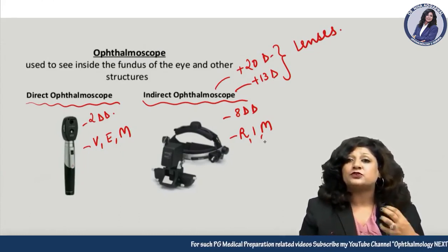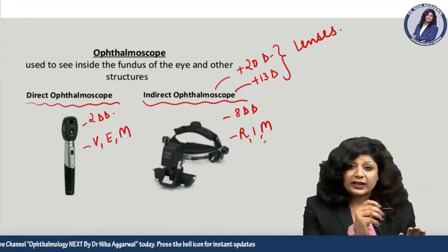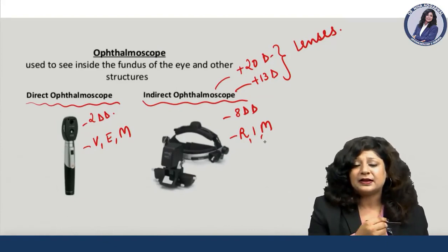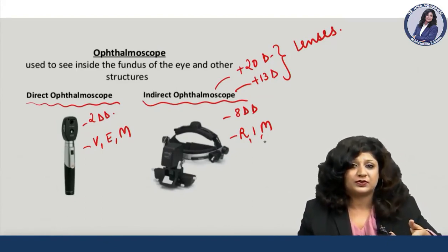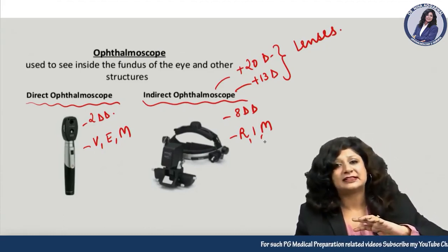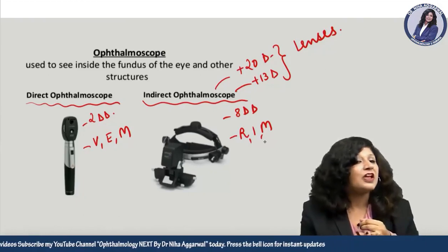So whenever we draw the diagrams, whatever you are able to see while visualizing through indirect ophthalmoscopy, whatever we have plotted here is just the opposite. For example, if you see a hole in the supratemporal quadrant, it means it is on the opposite side, in the infranasal side. So it is exactly the opposite. Alright. So here we have real, inverted and magnified.